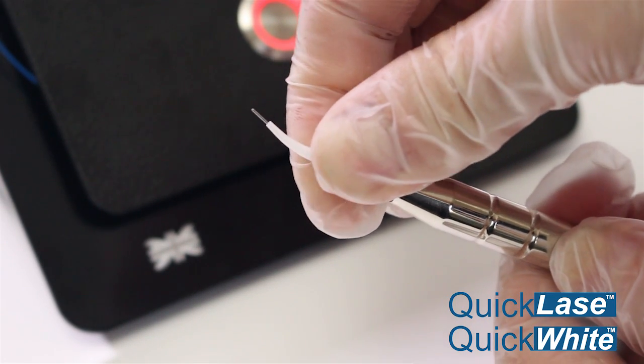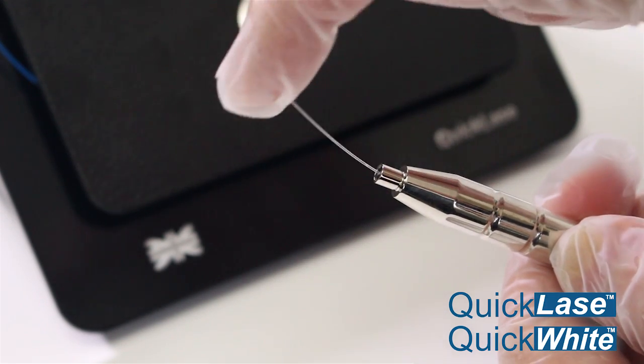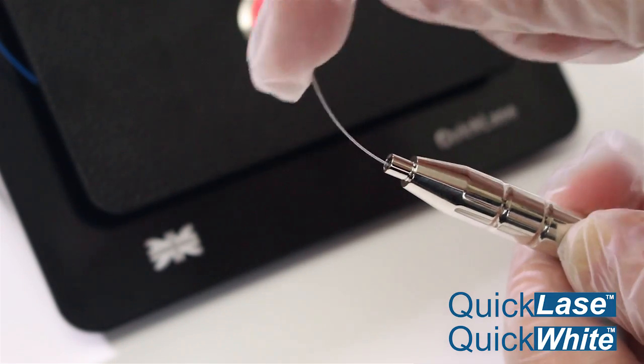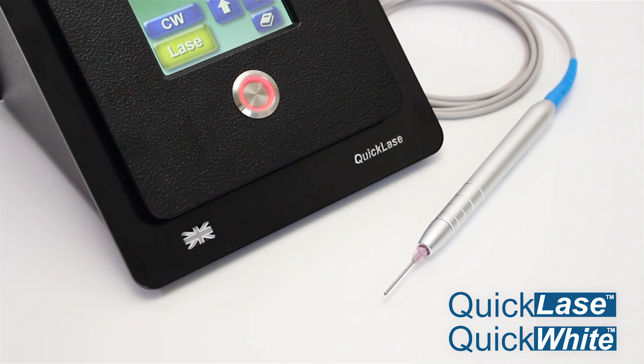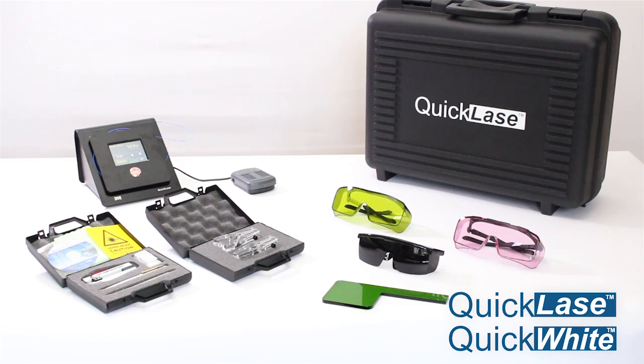The QuickLays lasers have low running costs with disposable tips and a durable continuous fibre. Also available with a disposable fibre tips handpiece. All lasers have pre-set menus with 20 of the most common procedures. Carry case and accessories from reputable manufacturers.